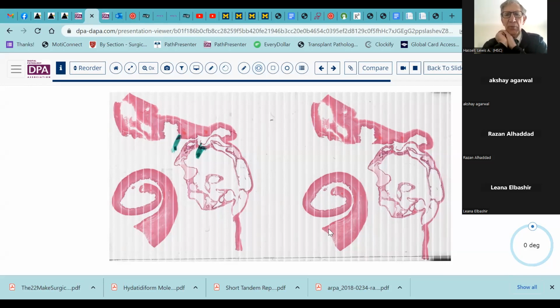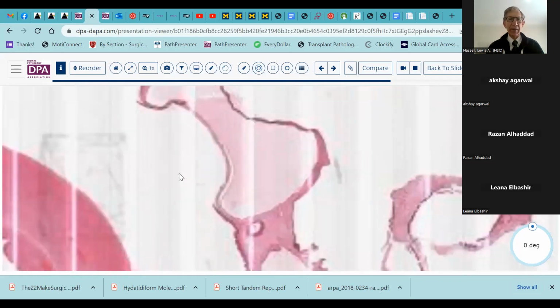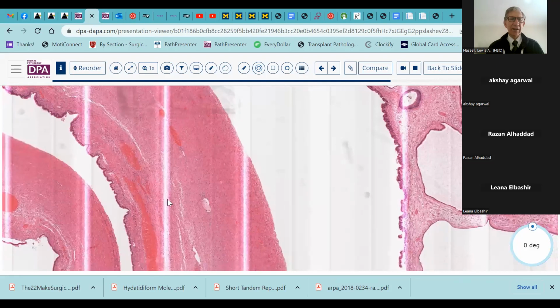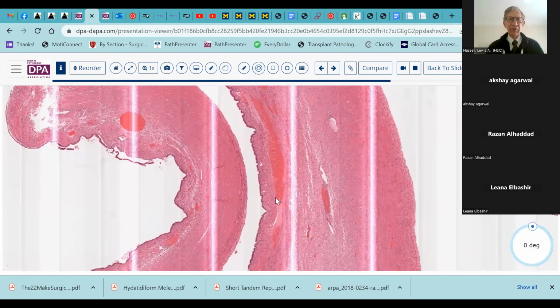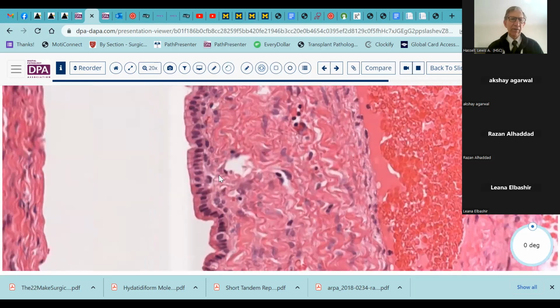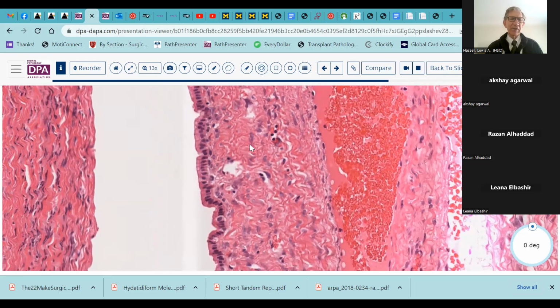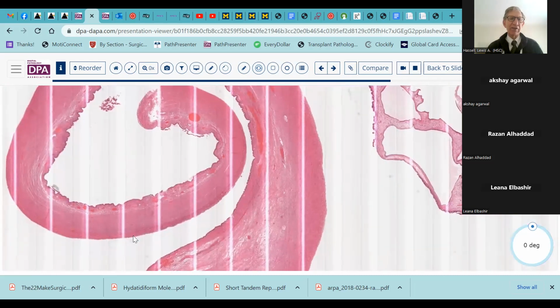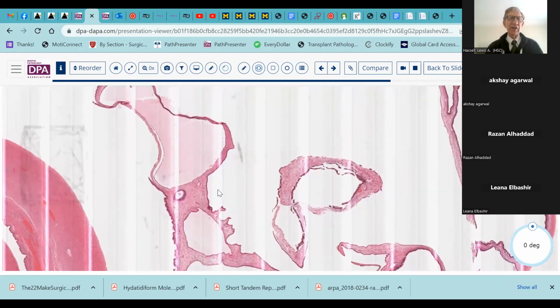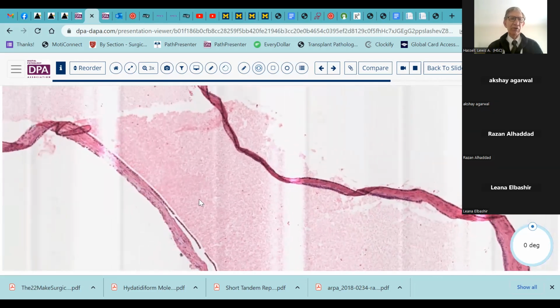So obviously this is not a normal fallopian tube because we're not seeing a normal lumen, and yet we see a complex cystic structure and a sort of coiled structure here. Many times this is the kind of circumstance we get. We get maybe a dilated tube. As it would appear, this is fallopian tube type epithelium here, or at least could be. In general, we'd like to see ciliated epithelium, and this does not look particularly ciliated, but it does have a muscular coat. And that's an important feature to be looking for, the presence of smooth muscle. That can help to define the presence of the fallopian tube when you've got smooth muscle.